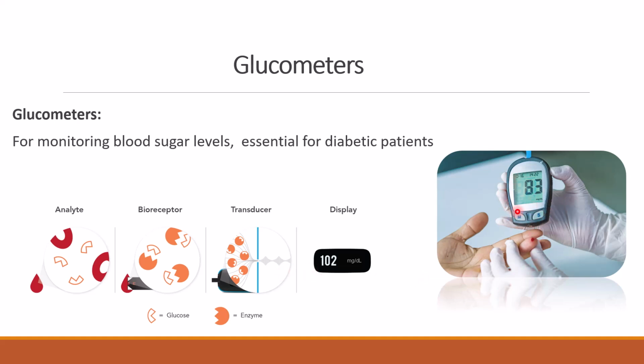It's very important to monitor the blood sugar level of the patient, especially for the diabetic ones. And maybe it's also very important for the patient after taking, for example, some kind of nutrition or some kind of medications. We are going to talk about that later.